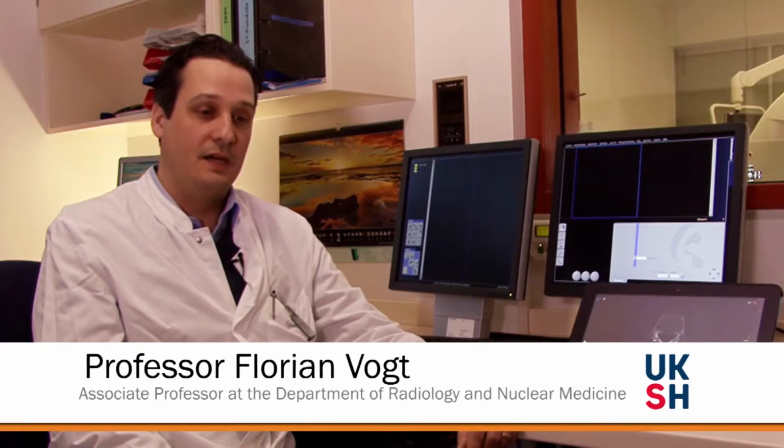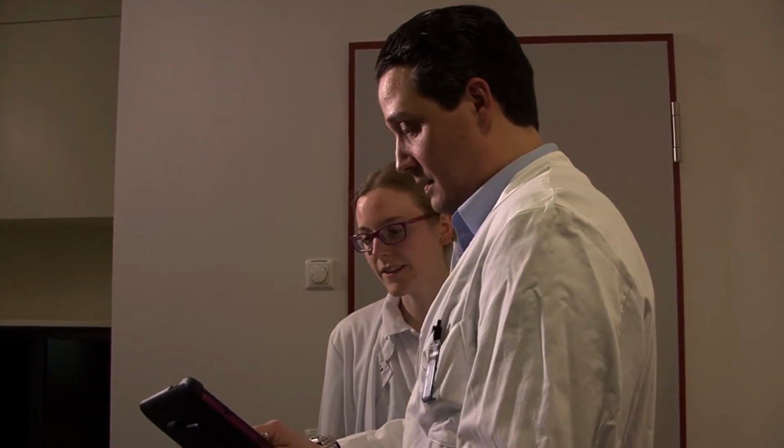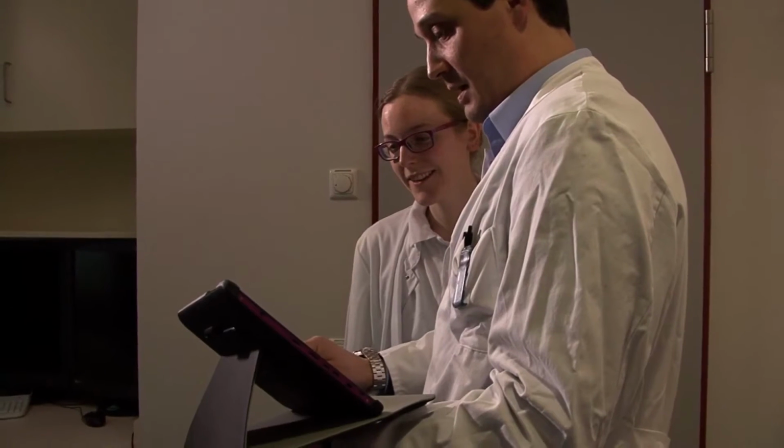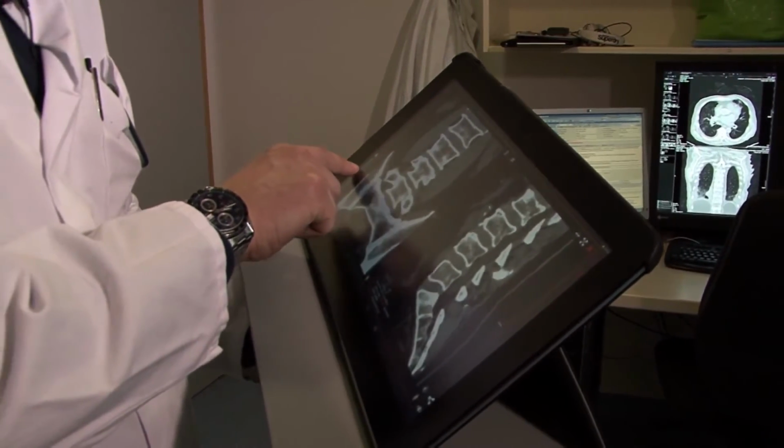We do believe that the devices that we use right now are inadequate because they do not provide all the opportunities that we need for professional reading. You can use these devices as well as for the on-call imaging and second opinion look, but you can also imagine to use these devices, for example, for bedside imaging on ward rounds or at the emergency department.